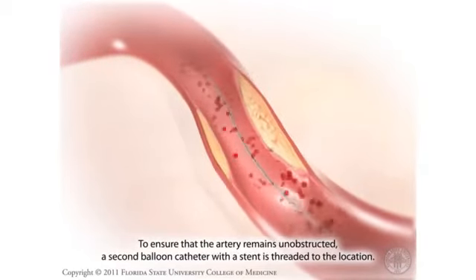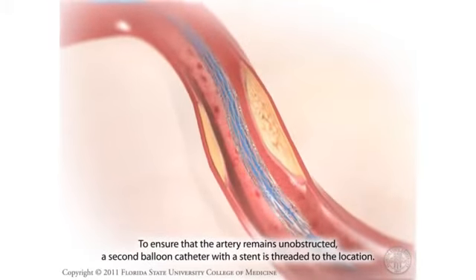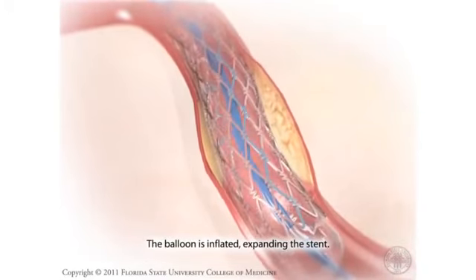To ensure that the artery remains unobstructed, a second balloon catheter with a stent is threaded to the location. The balloon is inflated, expanding the stent.